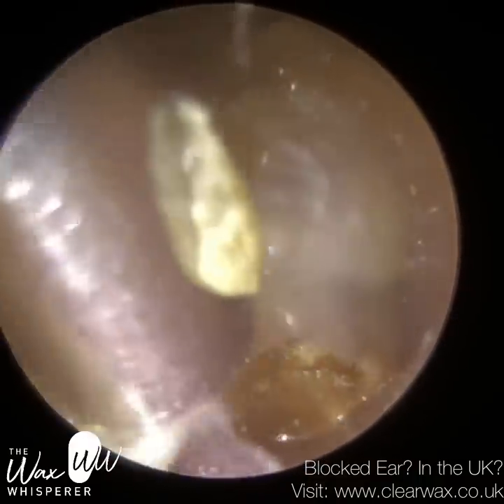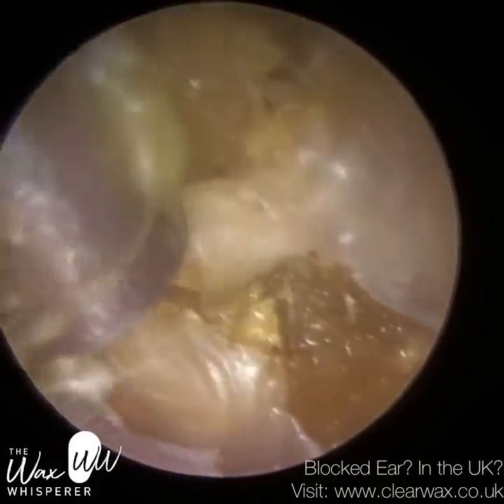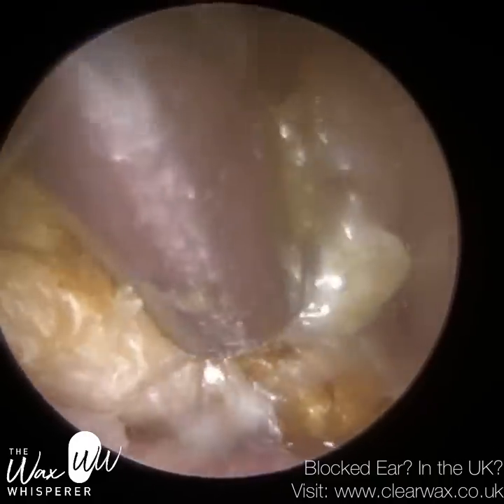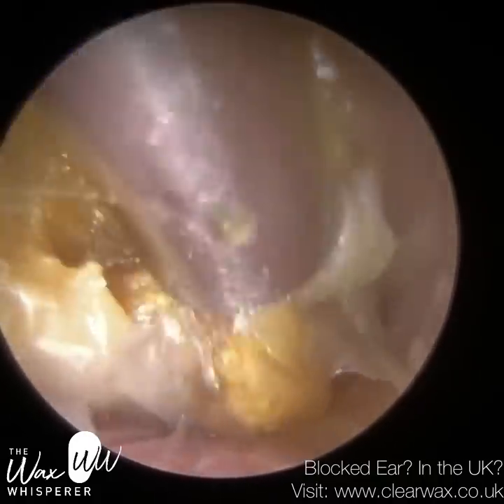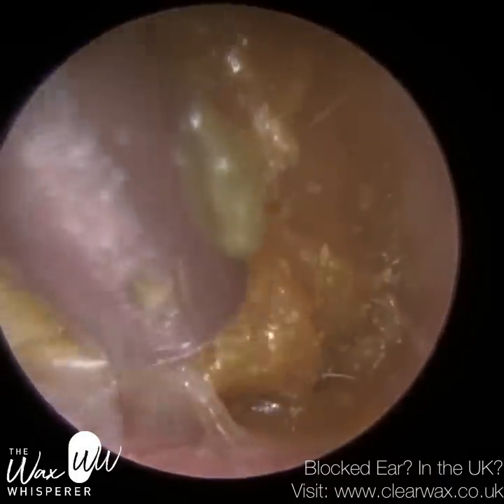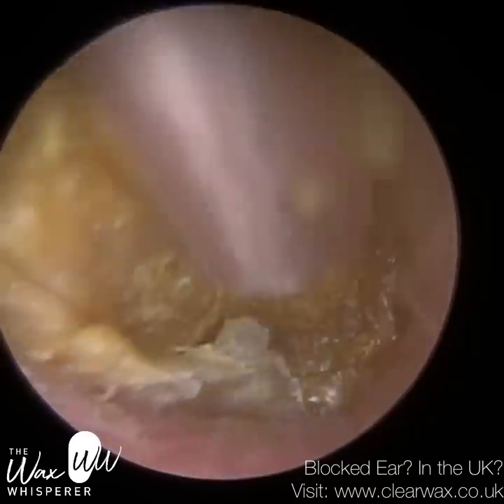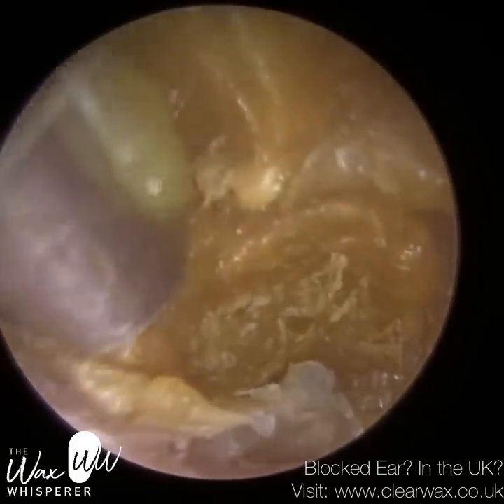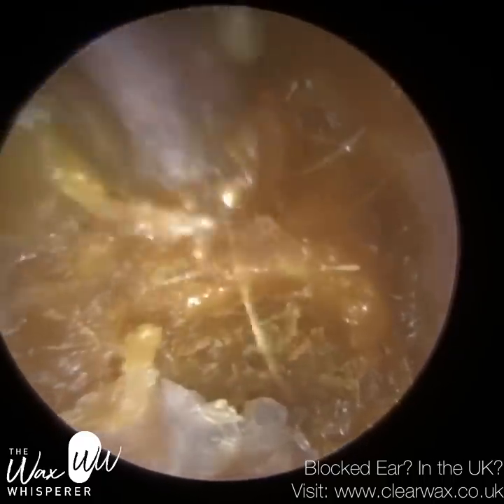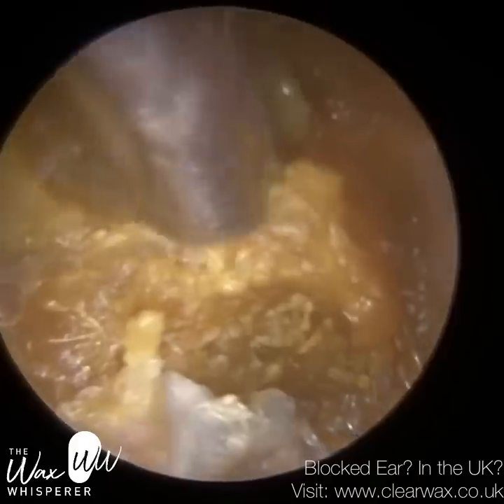You can see it's already taking shape. This plug of wax and soft keratin is enveloped by a layer of skin — a freshly shed layer that has died. In normal circumstances, that skin would migrate and move sideways out of the ear, but because of how blocked this ear is, it attaches itself to the plug and eventually becomes one with it, widening the plug even further.